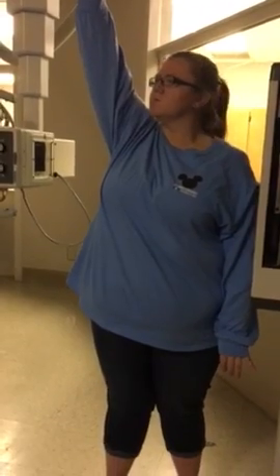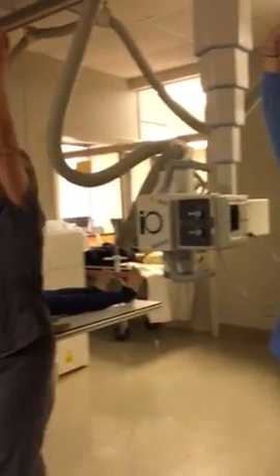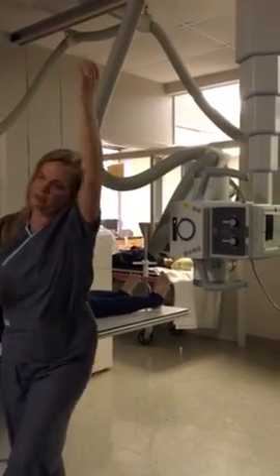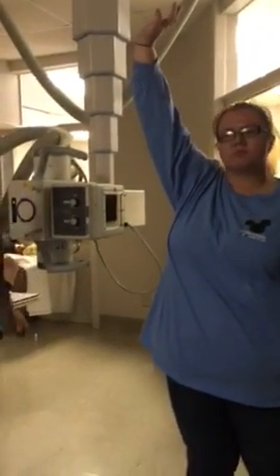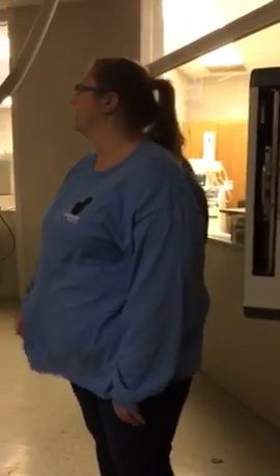Would that still be swimmer's position? For swimmers, you're going to be opposite. They're going to be on their arm and you're going to shoot this way. Okay? Power to the feet. You're good. Alright, AC joints.